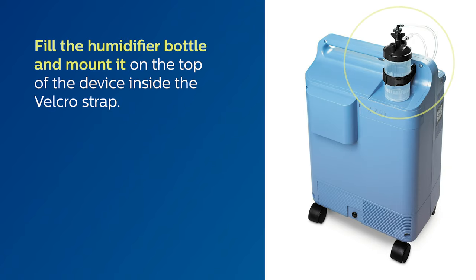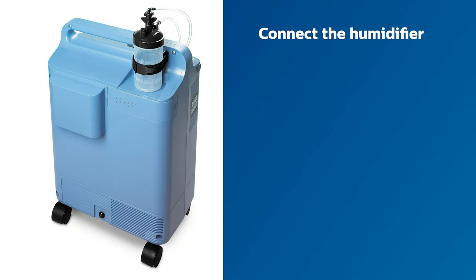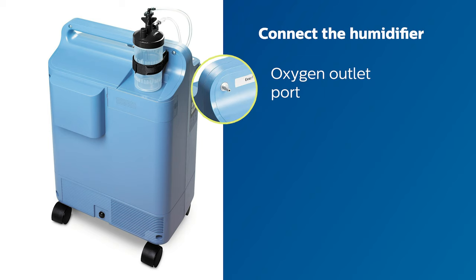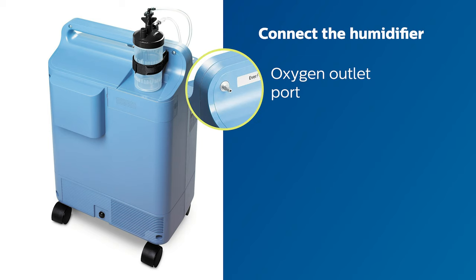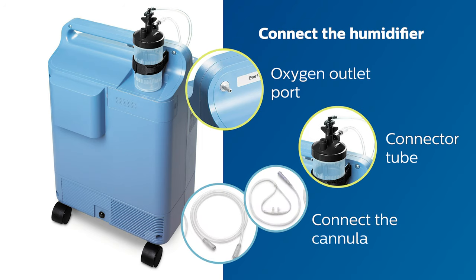Fill the humidifier bottle and mount it on the top of the device inside the Velcro strap. Tighten the strap around the bottle and secure it so it is held firmly in place. Connect the humidifier connector tube to the oxygen outlet port. Connect the other end of the humidifier connector tube to the top of the humidifier, with the elbow in the tubing facing the front. Finally, connect the cannula to the humidifier bottle.